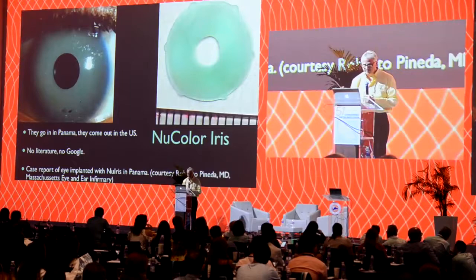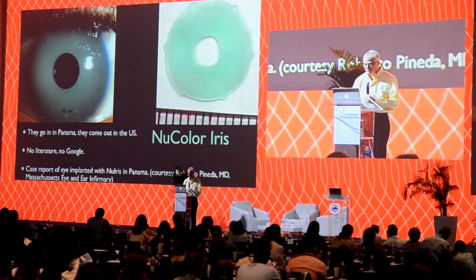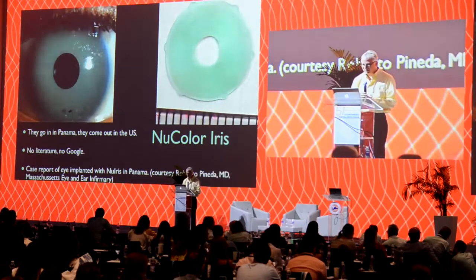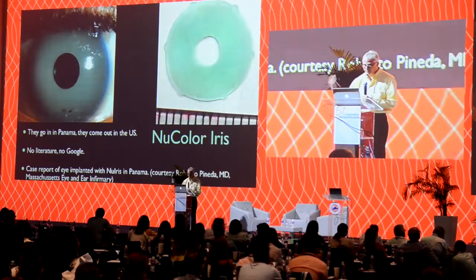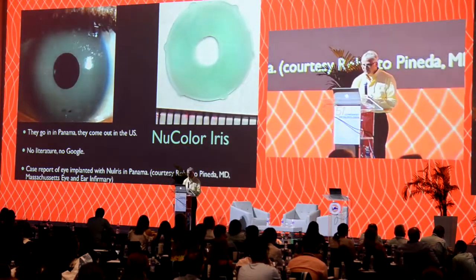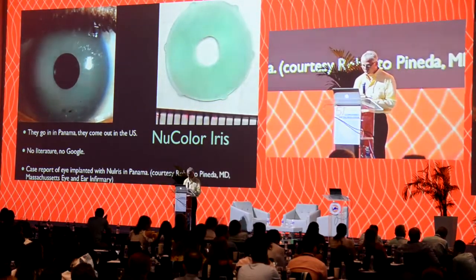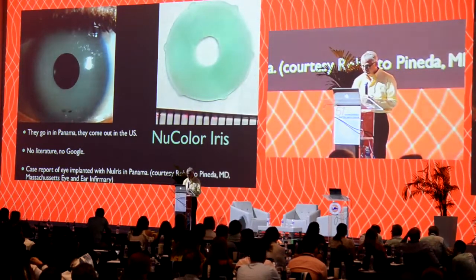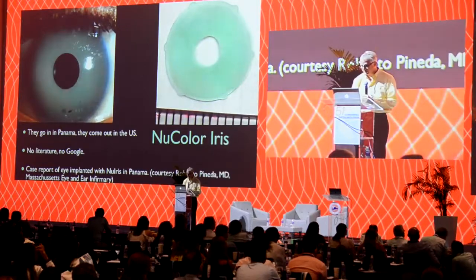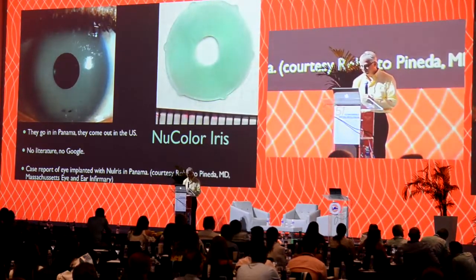Do not confuse these devices with the new color iris, or what's now being called the bright ocular iris, implanted in Panama, implanted in Mexico, implanted in Lebanon, among other places. These devices have a long trail of blind eyes behind them with large case series reported in the peer review literature. There has yet to be any reports in the peer review literature of safe implantation of these devices. These are not the same thing. These are put in front of the iris. They are not the therapeutic ones.